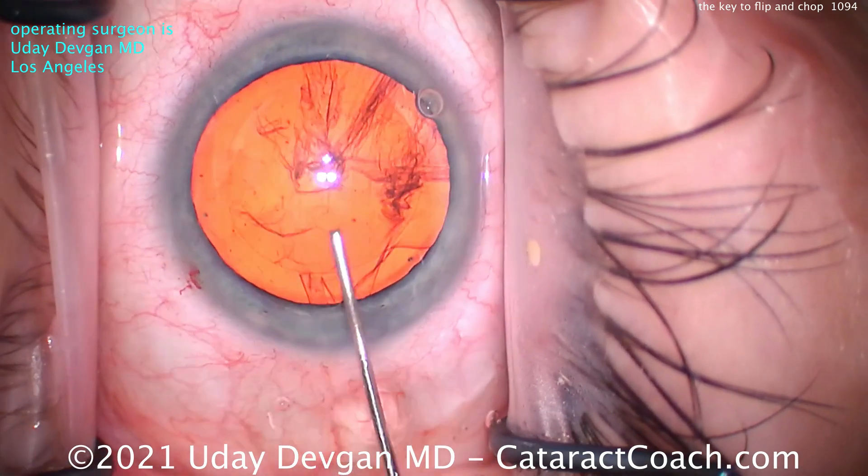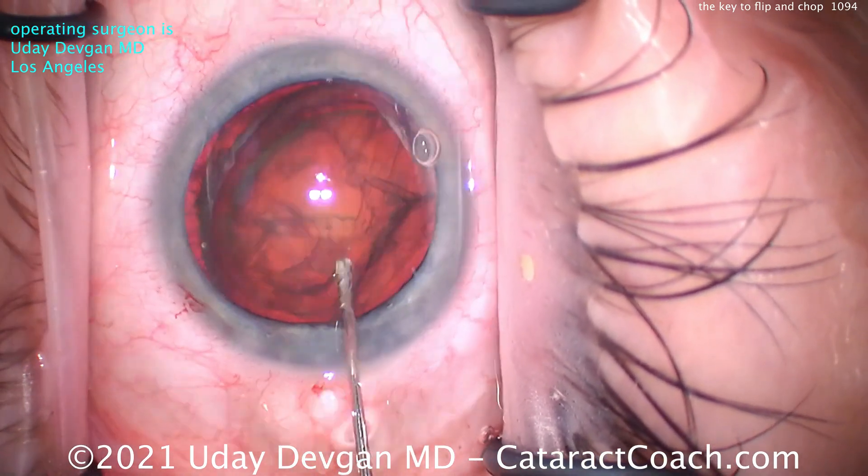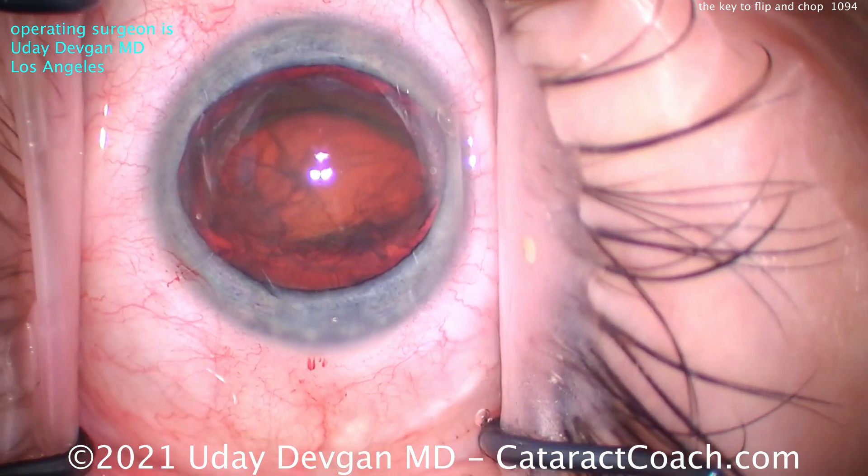Balance salt solution — we're going to do some hydrodissection. The key here is slow and steady. Get that nucleus up out of the bag.